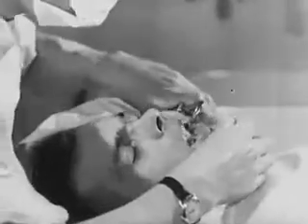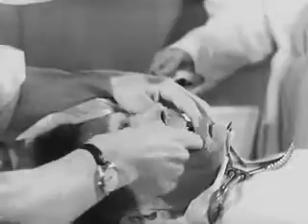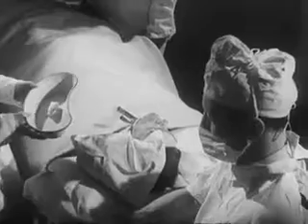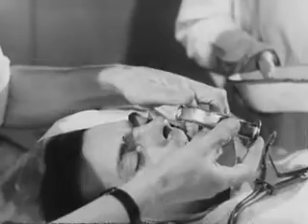First, the saliva must be cleared out. He opens the patient's mouth and finds false teeth. Where anesthesia is to be light, some anaesthetists prefer them left in, but you must know that they're there. Being edentulous, his lips may obstruct his breathing. It's a good idea to put in an airway.